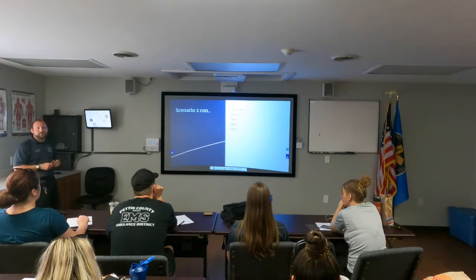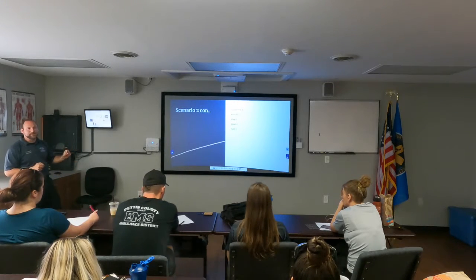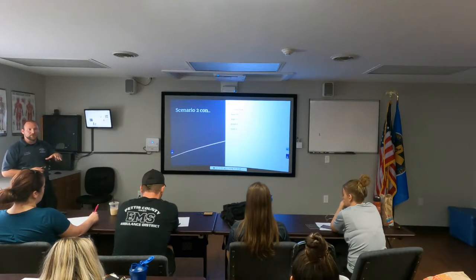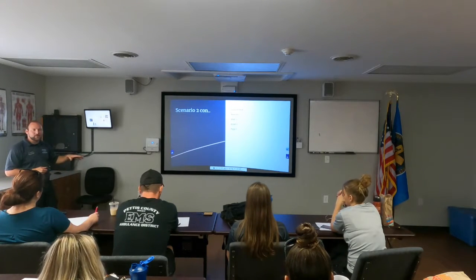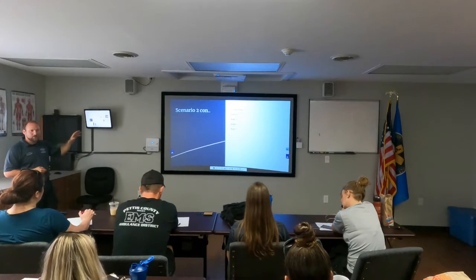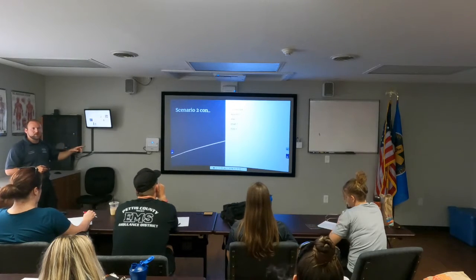What was that? 8. How'd you get 8? And 2. Okay, why did you get 2? Because of high CO2. Yep. So if you look back at the little cheat sheet that you have on there, your high CO2, we want to try and decrease that. We want to increase our pressure support by 2. So our new pressure support should be 8.